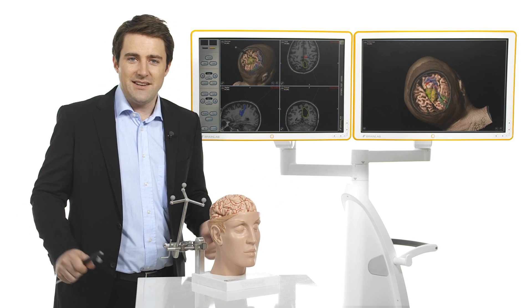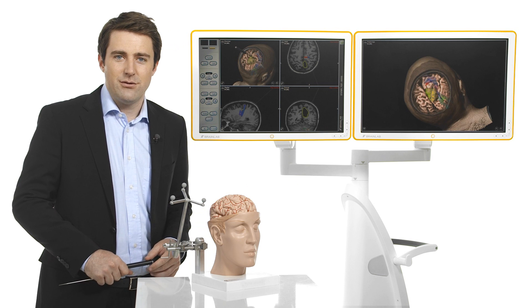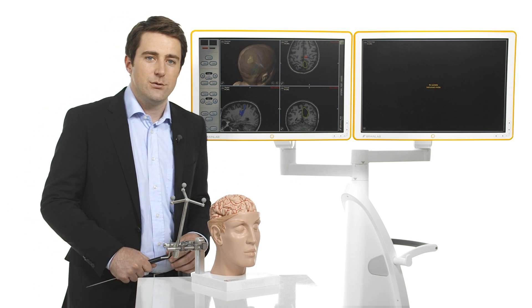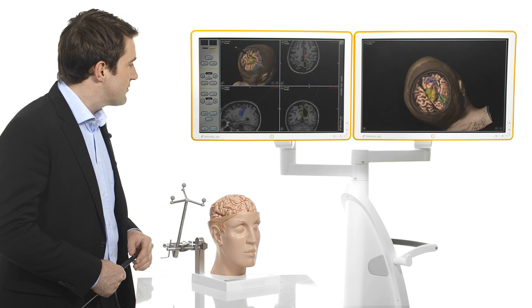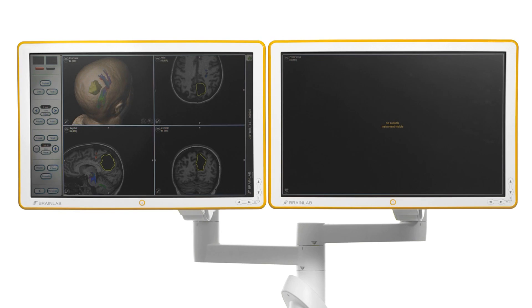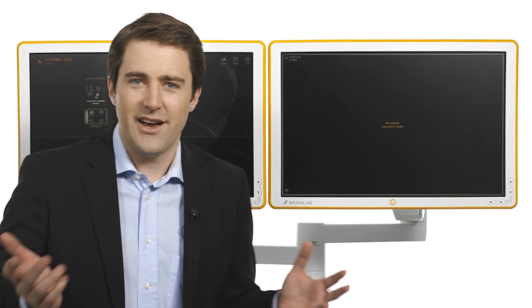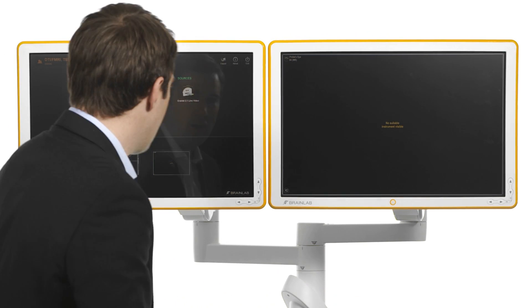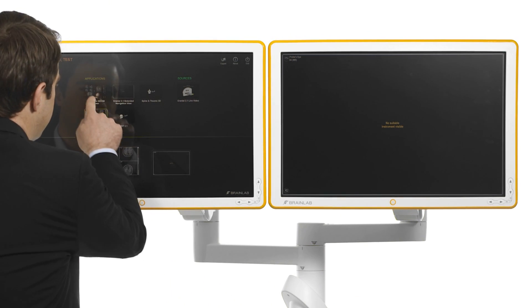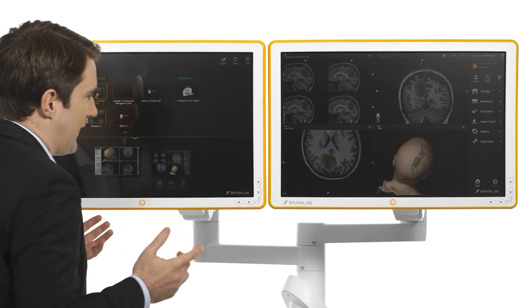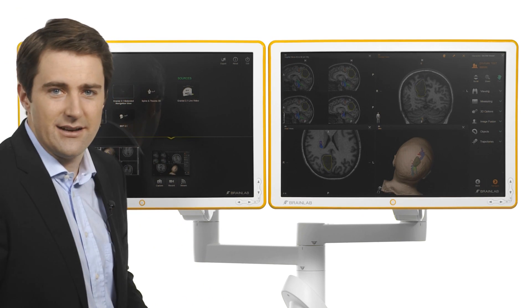With the extended navigation view there is no need to switch between views on one screen. With the second monitor I can also run the DICOM viewer in parallel for static image viewing or to add any extra data.